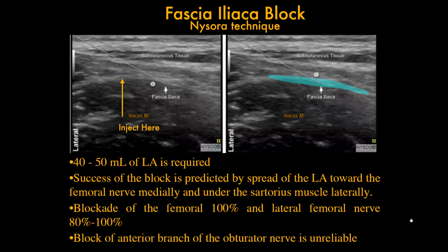Now, I'm suggesting this to you for the hip fracture patient because they're not ambulatory the first day. And by getting the femoral nerve, you not only get the osteotomes to the femoral head and neck, but you also get the quad spasm that comes from the fracture. So when your bone is fractured, your body is tensed up because the bone articular spikes are rubbing into each other and everything tenses up and there's a lot of quad spasm. So the fascia iliaca is a no-brainer for me for all our hip fractures, all our gamma nails.